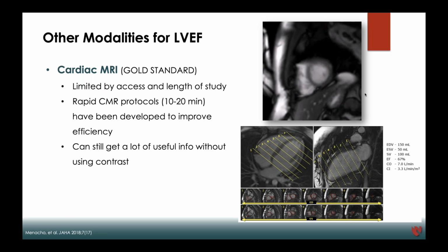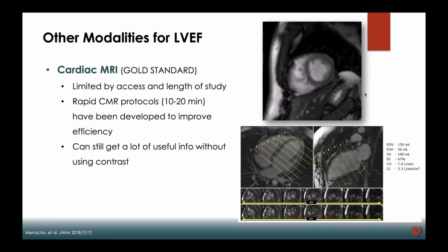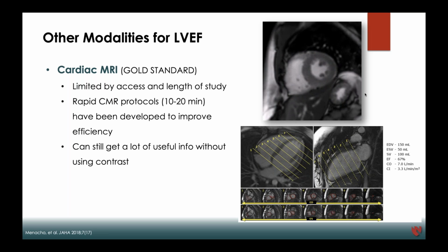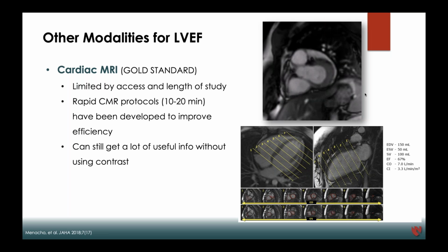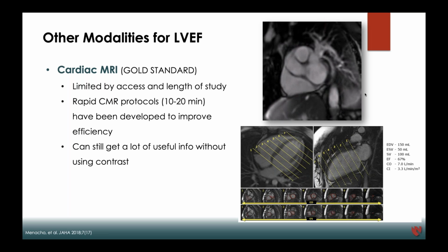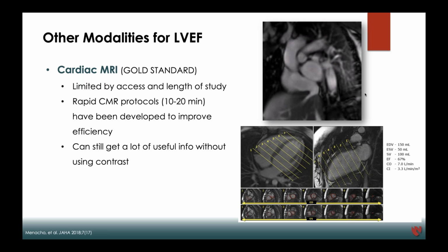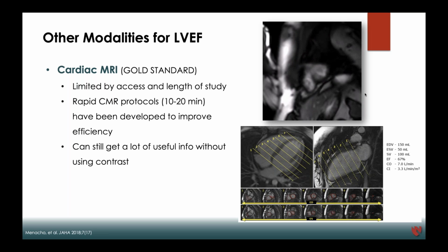But cardiac MRI is generally limited by access. It's not at every center, especially smaller hospitals may not have cardiac MRI. Length of study and the patients being claustrophobic and in the cardiac MRI for upwards of an hour, if it's a lengthy contrast study where you're doing a lot of sequences, that can be an issue for some patients. But we shouldn't think that every exam is going to be a burden to the patient because we can do a rapid CMR protocol, if we're just looking for an accurate ejection fraction and maybe a couple other non-contrast sequences.